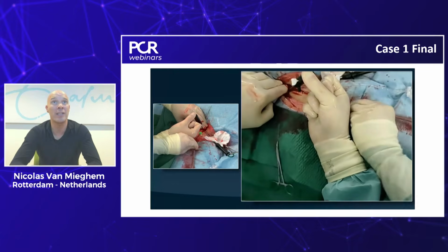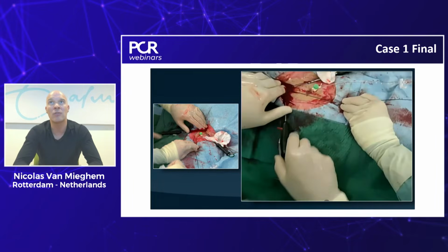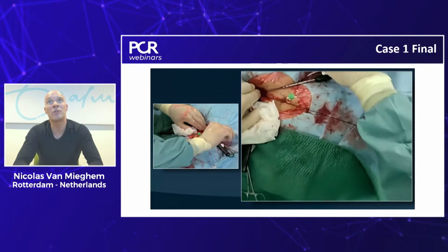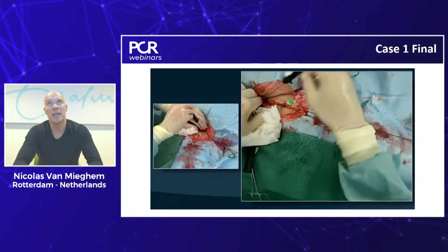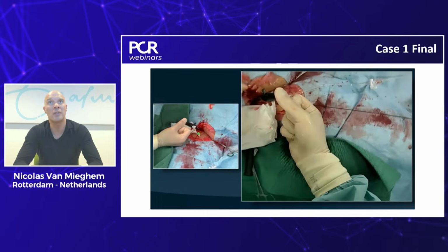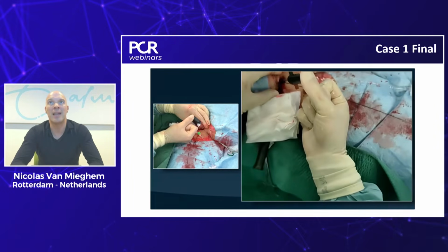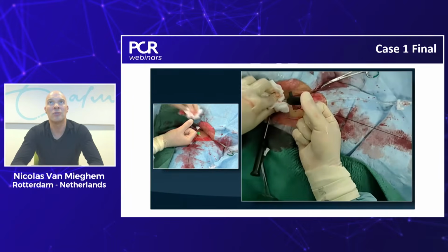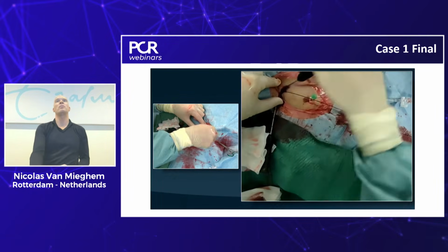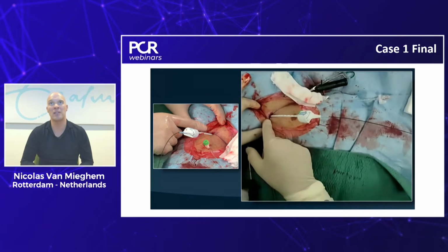Here we're already closing the groin. In the interest of time, I think it makes sense to already focus on this. So we used a pre-closure with 2 ProGlides. And again, I think most of us will be familiar with closing the sutures. But at the end of the 2 sutures, when we see that there is a residual ooze, we make the decision whether or not to proceed with an Angio-Seal, and this is what we're doing here.